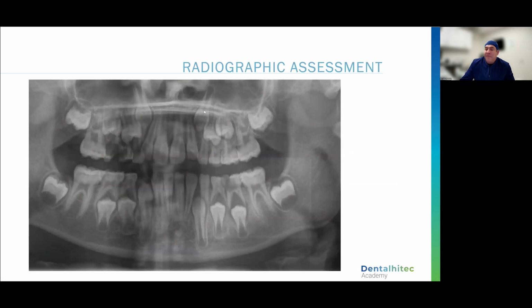I want to talk about infected areas, right? So you can see there's a significant amount of bone loss here with this infection. This is not an area, typically, let's say I was just doing composites or a pulp on K and L, I would inject on the interproximal between K and L there. But in this instance, I know I've got bone loss. I know that I will probably have issues if I try to inject into that bone that's not organized.